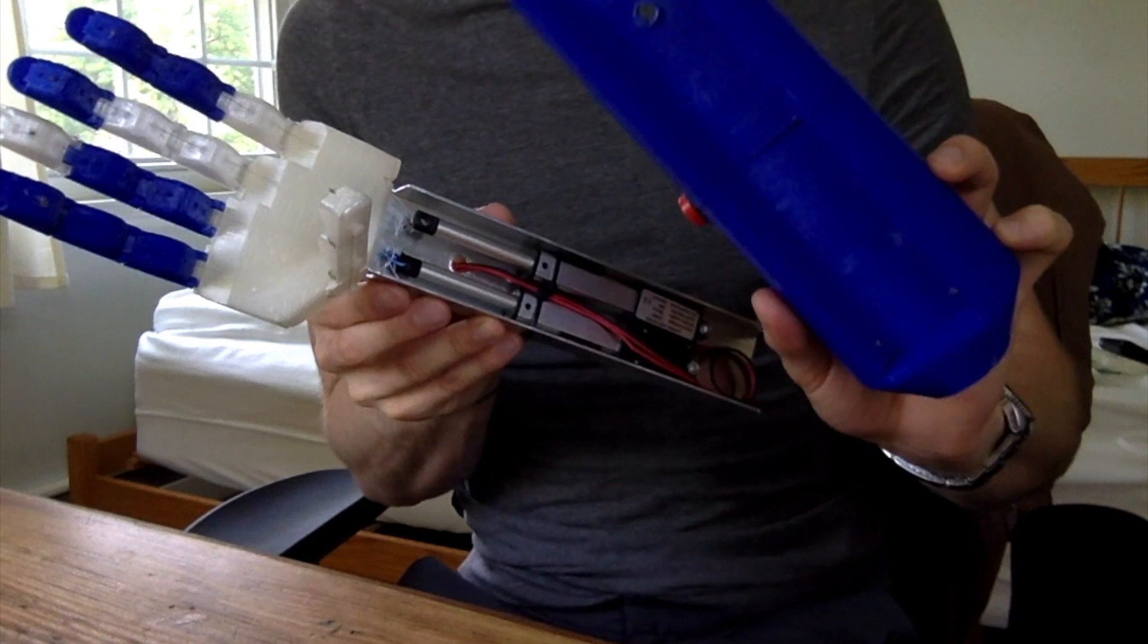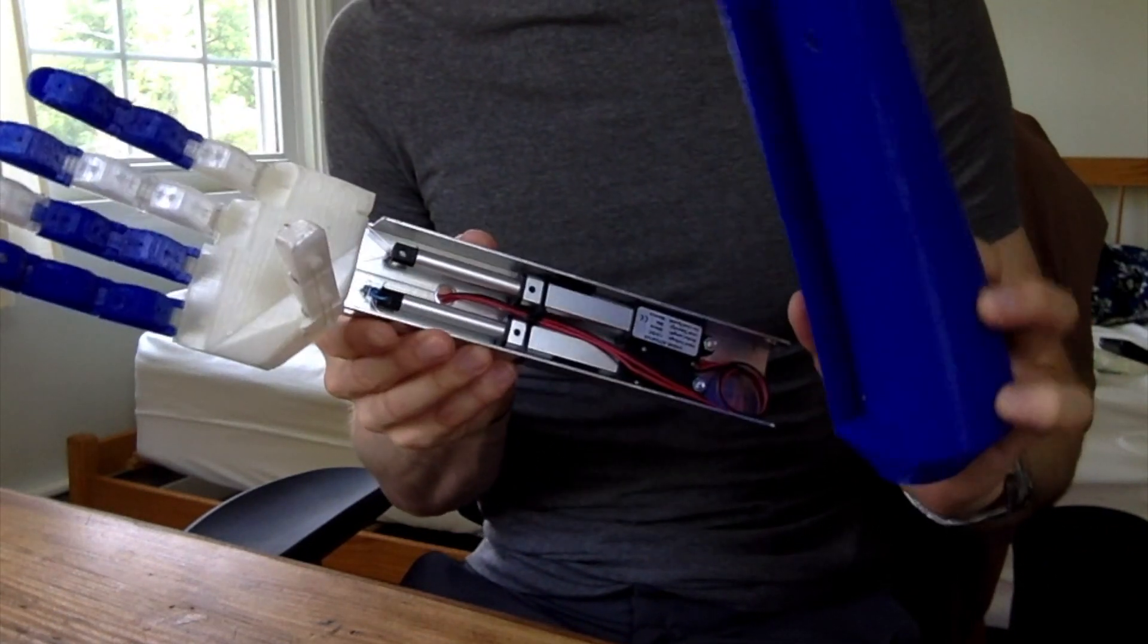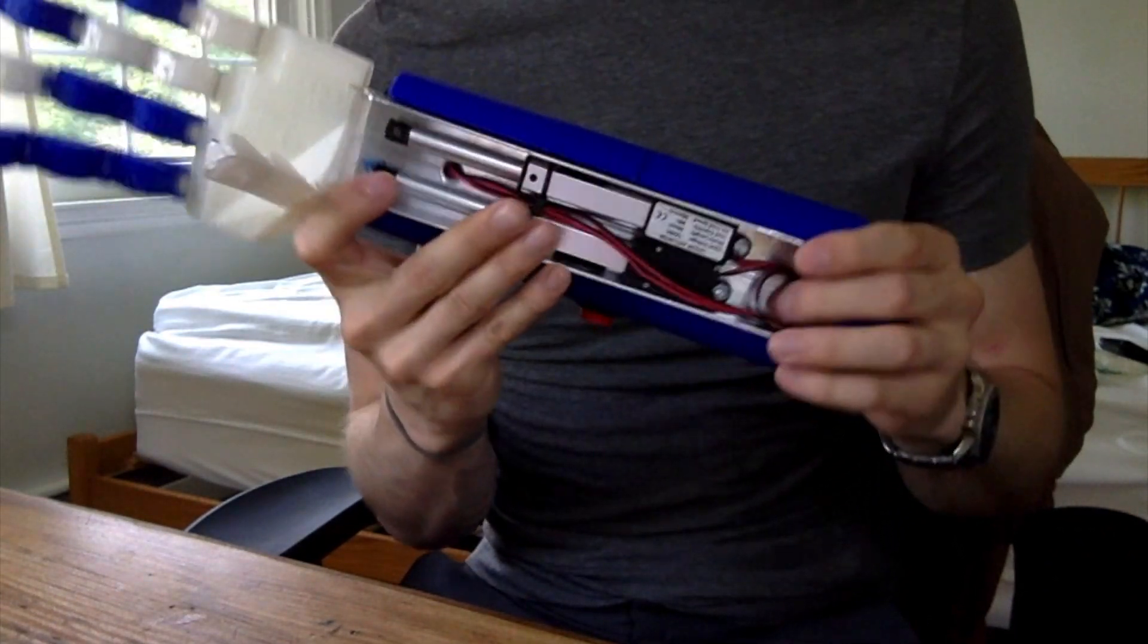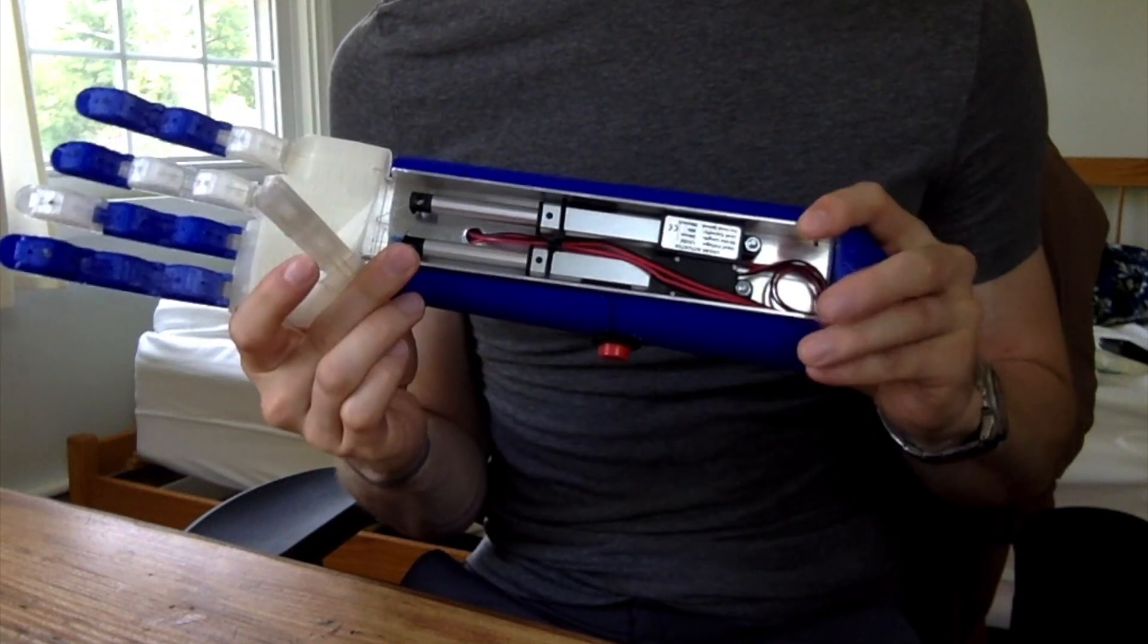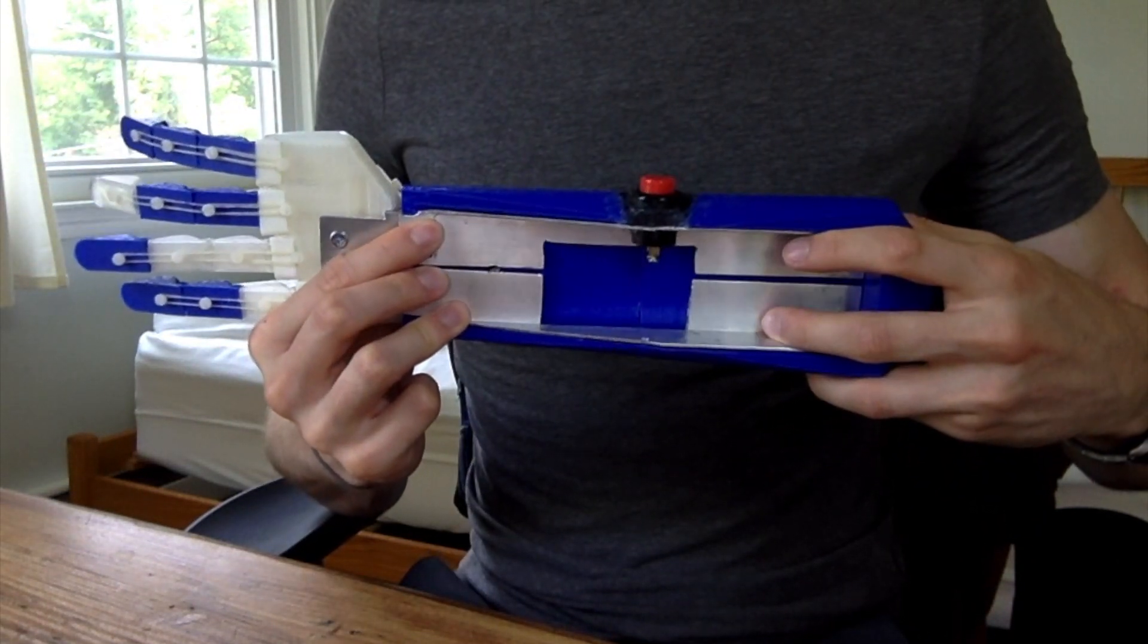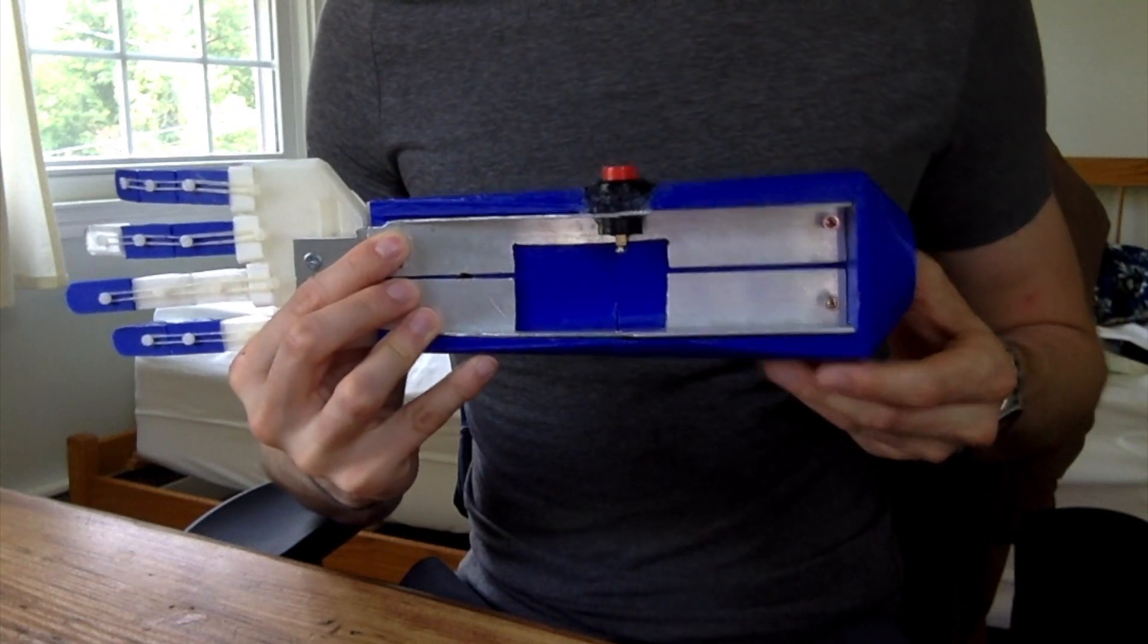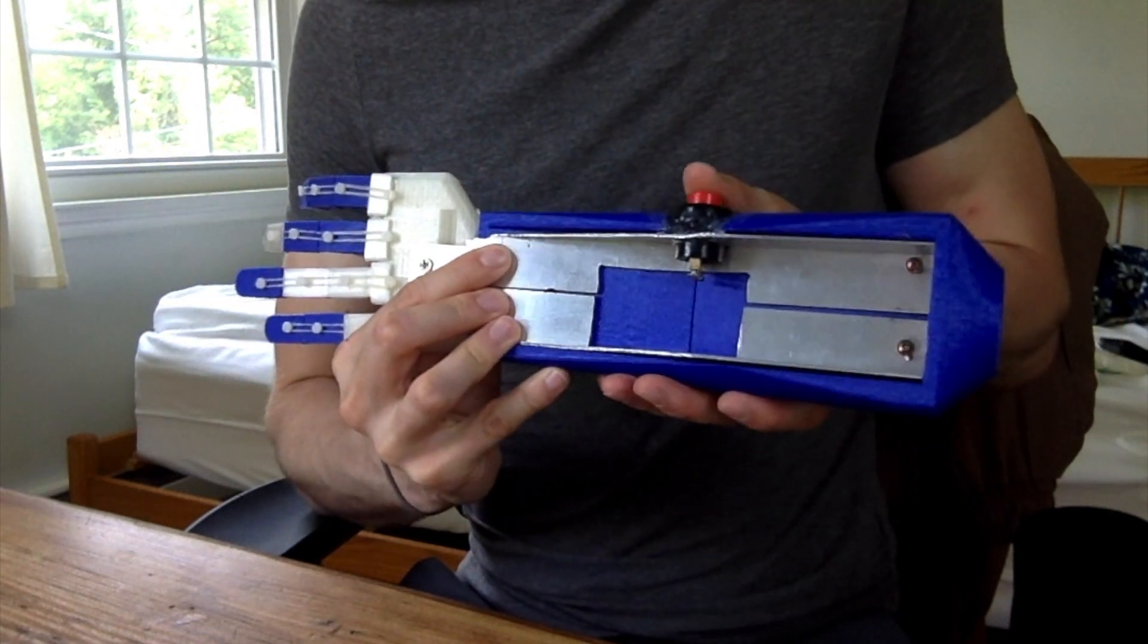The housing is going to form the forearm of this prosthesis. I 3D printed this structure, which fits onto the system we already have. The back has space for the battery and electronics. I already added some aluminum extrusions for support, as well as a push button to open and close the hand manually when the muscle sensor isn't attached.